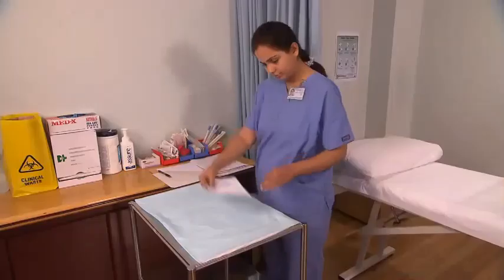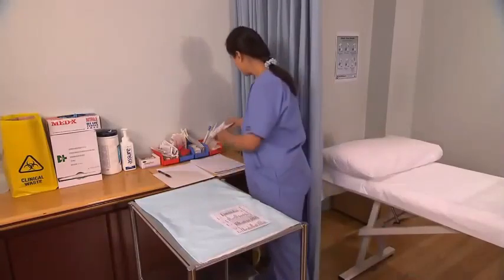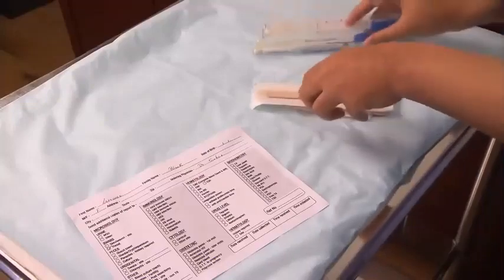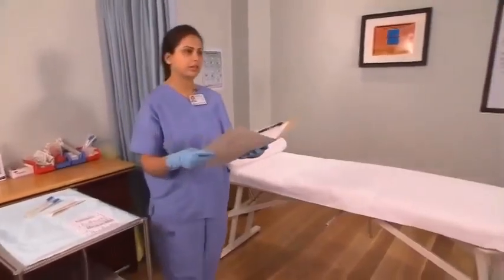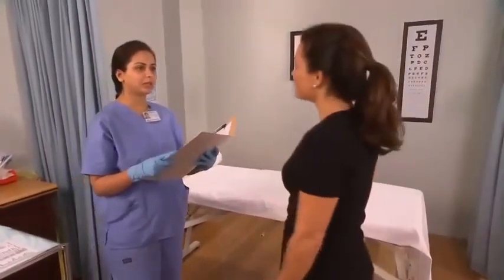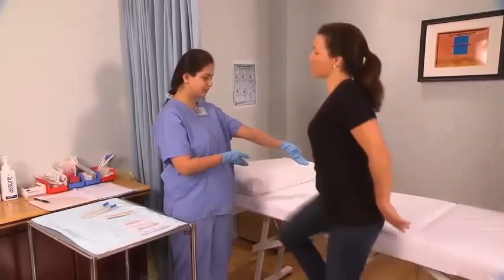Wash your hands, review the laboratory requisition form, and prepare the tray for the procedure. Put on gloves. Confirm the patient's details and explain the procedure. Then obtain verbal consent to proceed. Position the patient for the procedure.